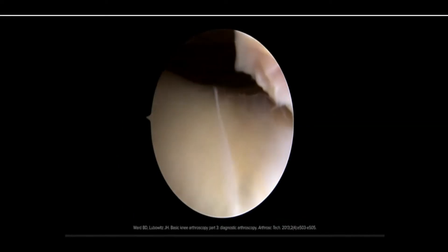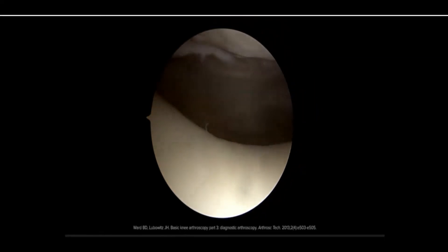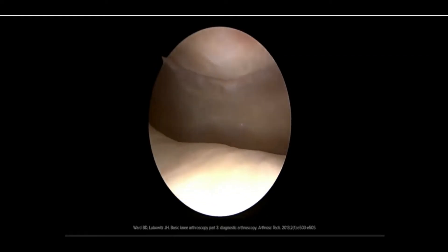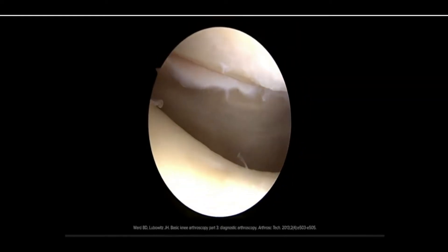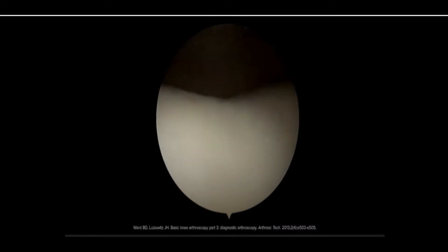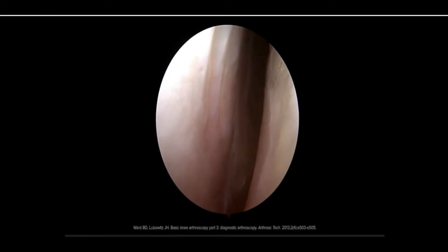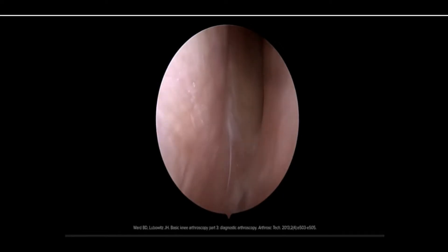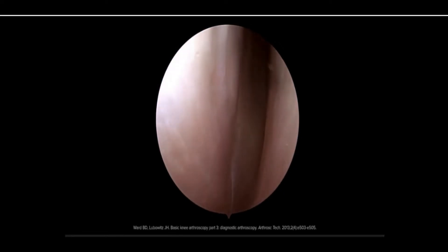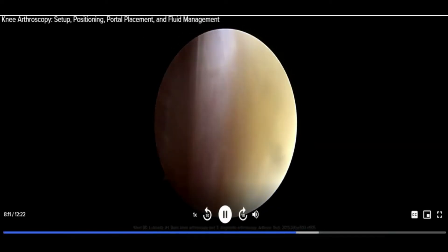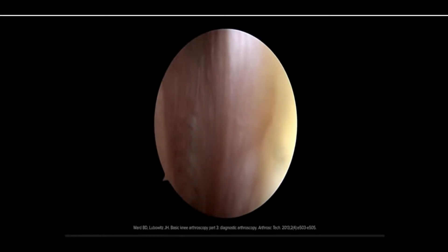The knee can be arthroscopically evaluated in a number of different patterns. It is good practice for the surgeon to develop a routine so no compartment is overlooked. One option is to start with the suprapatellar pouch — ruling out loose bodies — then move to the undersurface of the patella to evaluate for any plica or patellar and trochlear chondromalacia. Transition the scope to the lateral gutter to evaluate for loose bodies and femoral osteophytes, then sweep back over to the medial gutter for the same evaluation.